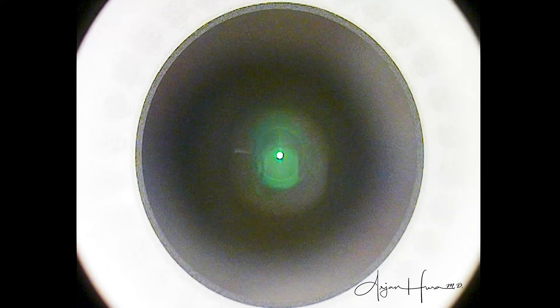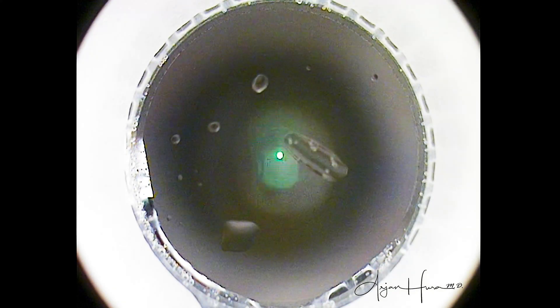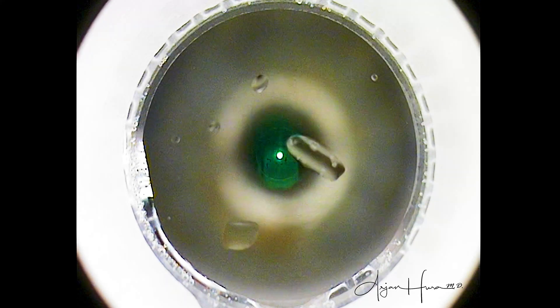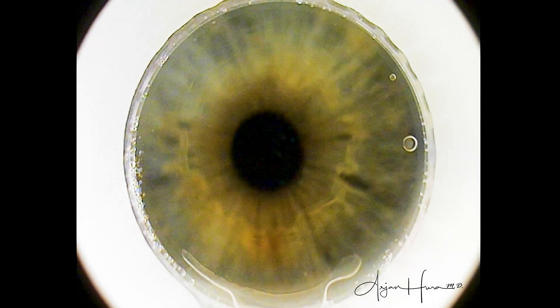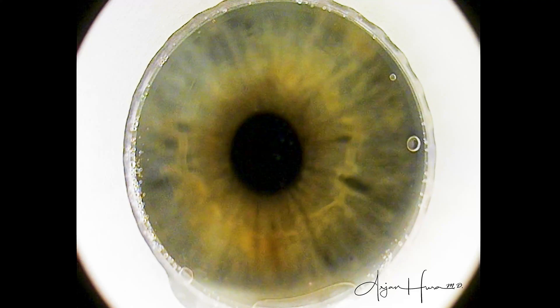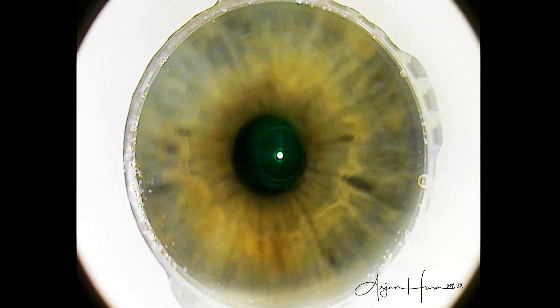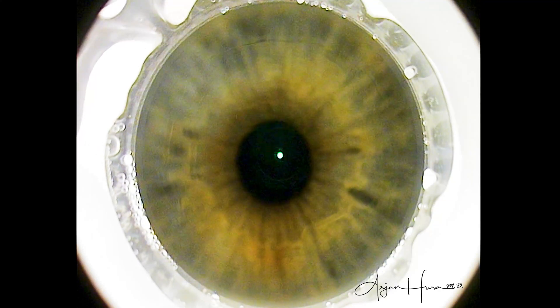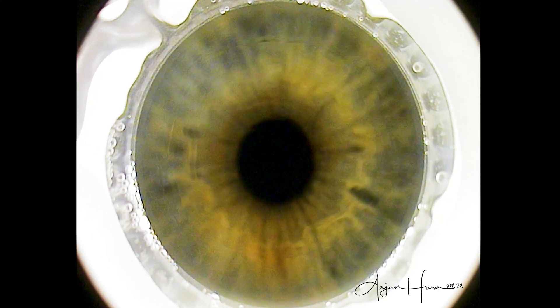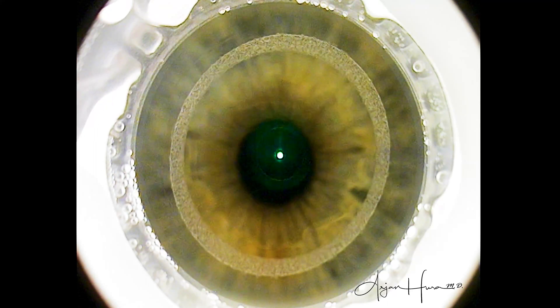Here, I was about to dock on the cornea but I saw a horizontal white line on the cone. This is a new glass cone, so I'm not really sure what that debris was, but it's extremely important that nothing be blocking the laser when it creates the lenticule, otherwise it can lead to a patchy area of black spots — sometimes referred to as black artifact — which can lead to a sticky dissection. Now, this is the patient's left eye, and as I'm docking on the cornea, I'm trying to align the green blinking light with the visual axis, which is again infranasal. However, I was slightly over-applanated, and when I hit suction, the light jumped a little bit to the corneal apex. Thankfully, it's aligned with the visual axis and there are no large folds in the epithelium. If you see folds, stop and re-dock.